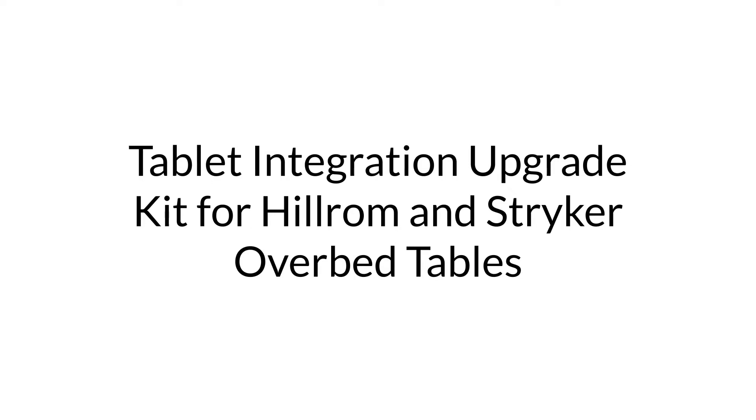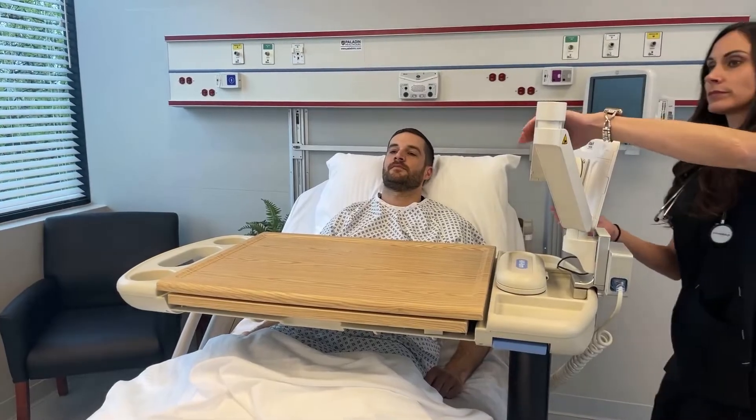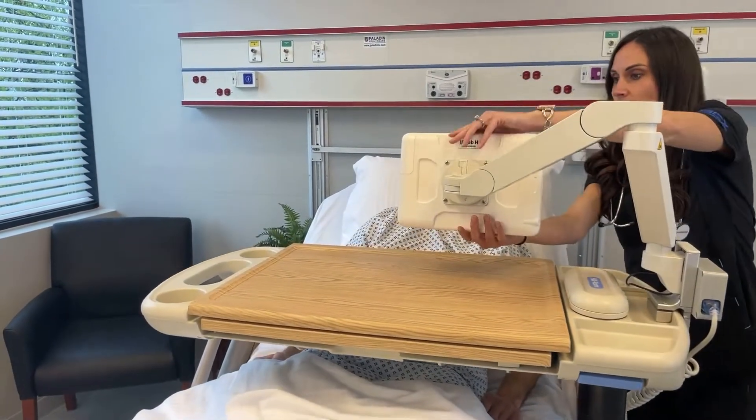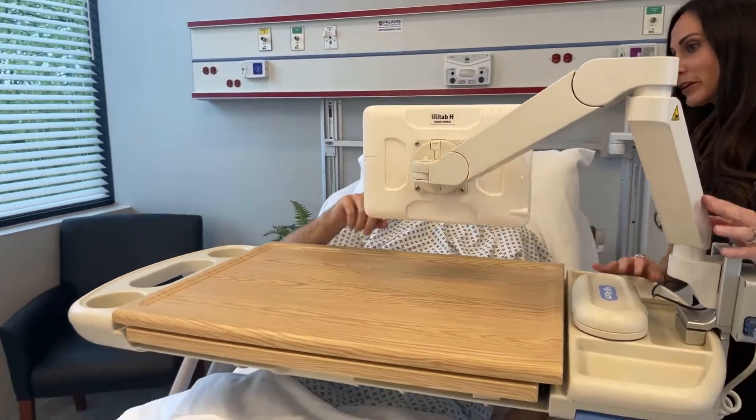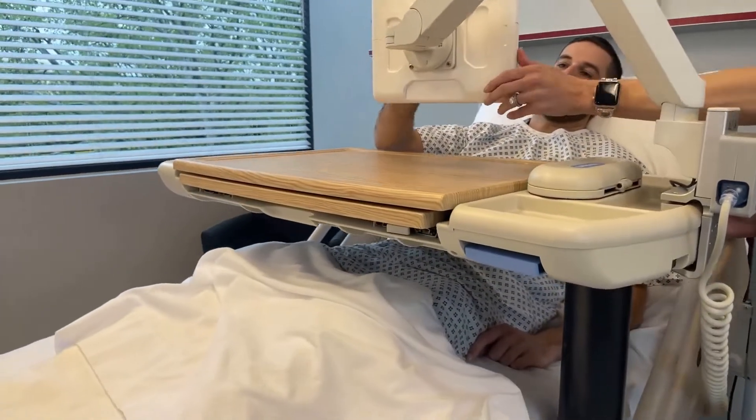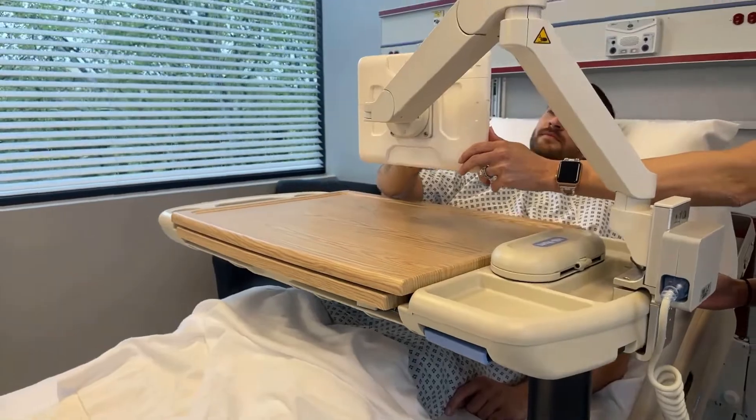In this video, we are going to demonstrate the GCX Tablet Integration Upgrade Kit for Stryker and Hillrom overbed tables. This addition to our expanding suite of patient experience solutions allows health systems to integrate tablets efficiently and cost-effectively onto existing overbed tables.